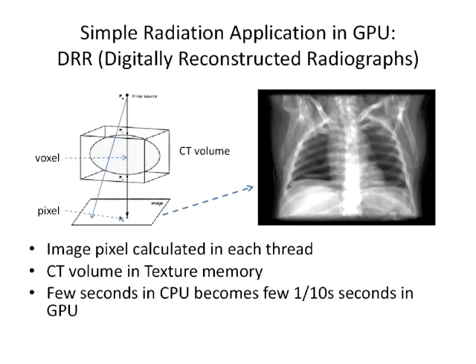We can do the ray tracing on the GPU with each ray as one thread, just following the ray where the body is intersected. Whenever the ray goes through a density or material property point, you add it up and then project it on the target image.